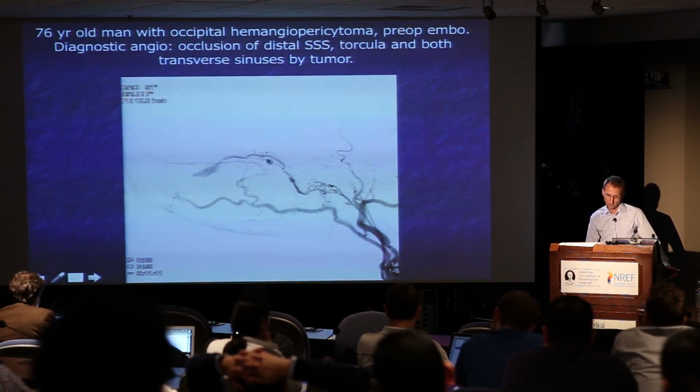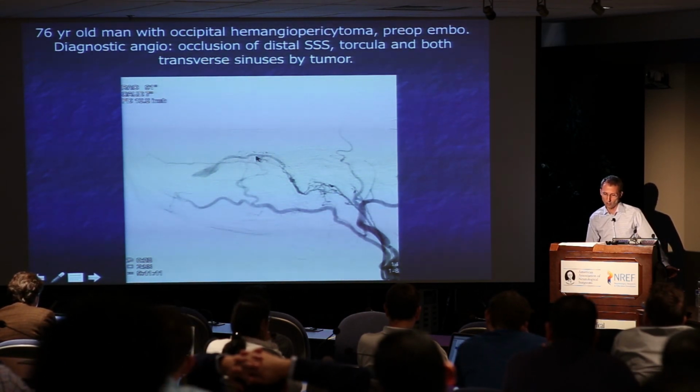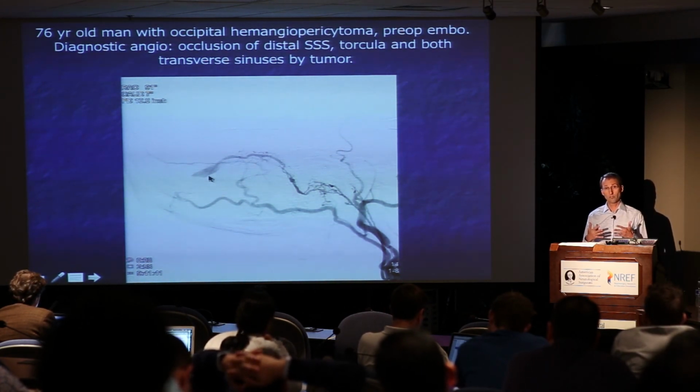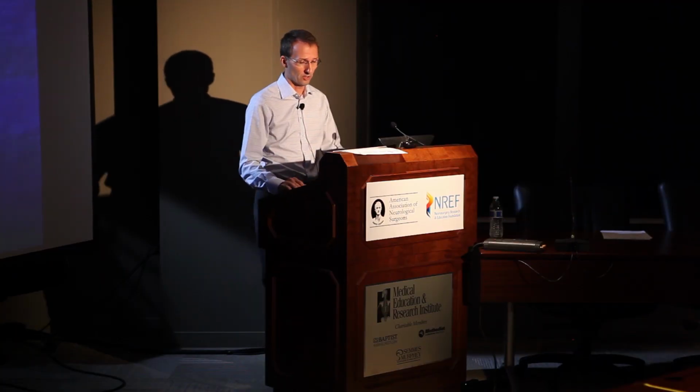So it may be that the fistula pouch is all along through here, but certainly the caliber changes here. There are transmastoid perforators coming from the occipital, running also here into the transverse sinus. Remember, the proximal transverse sinus is already occluded. We know that by the tumor.